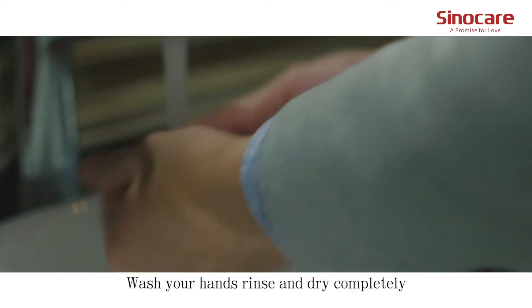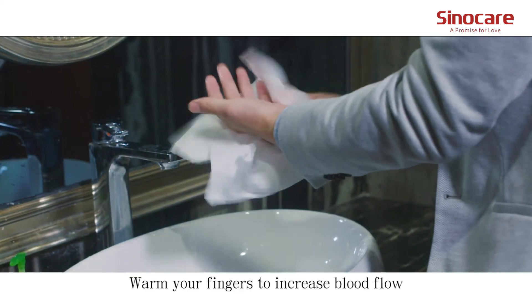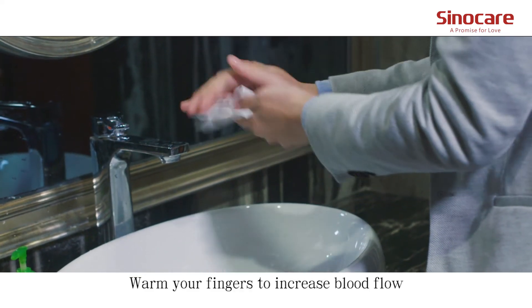Wash your hands. Rinse and dry completely. Warm your fingers to increase blood flow.